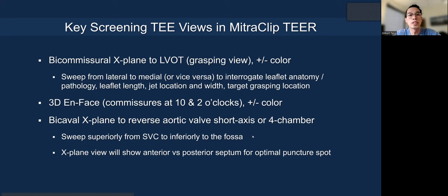What we do at our center is screen patients at our clinic with TEE the same way we do it during the procedure, so there are no surprises. You know exactly the imaging quality you're going to get and plan the procedure ahead, just like a TAVI procedure. We look at a bicommissural x-plane LVOT view — the grasping view — with or without color to show where the pathology and jet are. You do a sweep lateral to medial to interrogate anatomy, pathology, leaflet length, jet width, and target grasping location, to figure out how many clips you'll need, which clips, and where to clip.